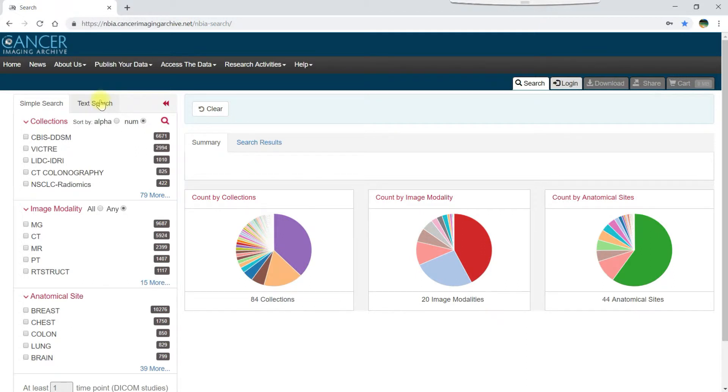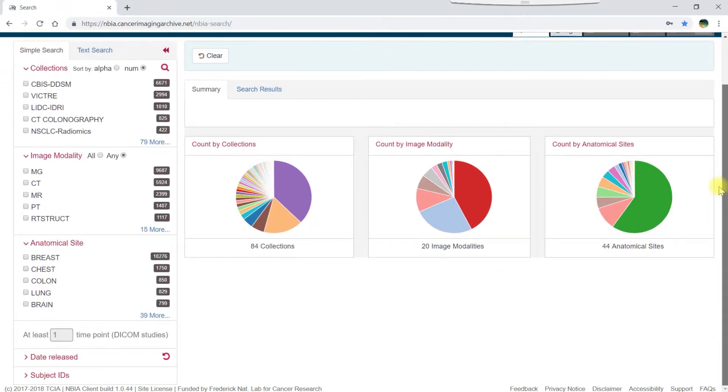The simple search involves selecting from the filters on the left, which are collections, image modality, anatomical site, date released, and subject IDs.